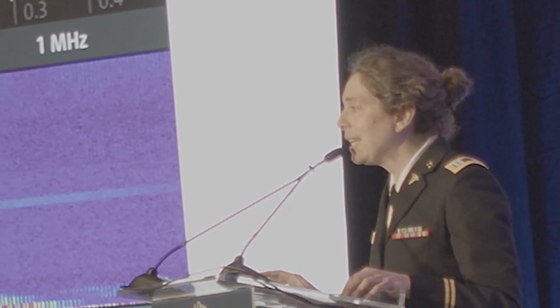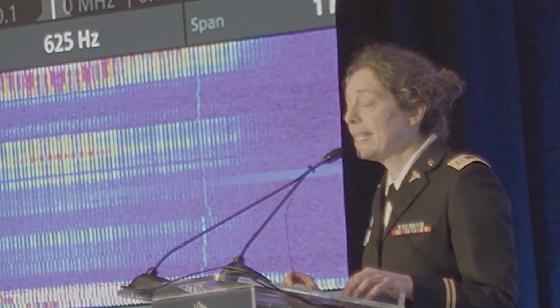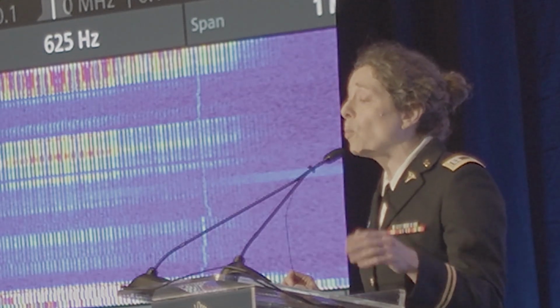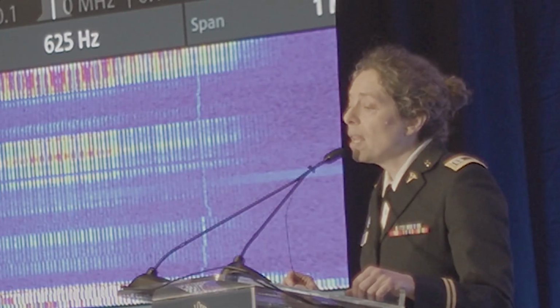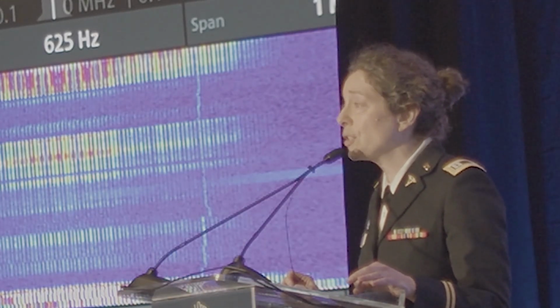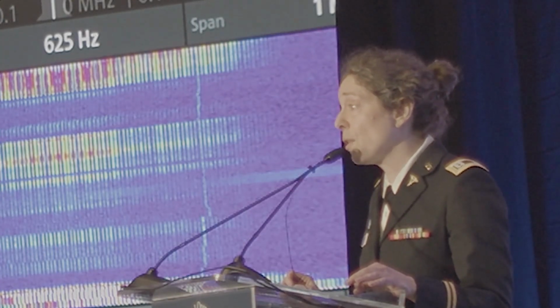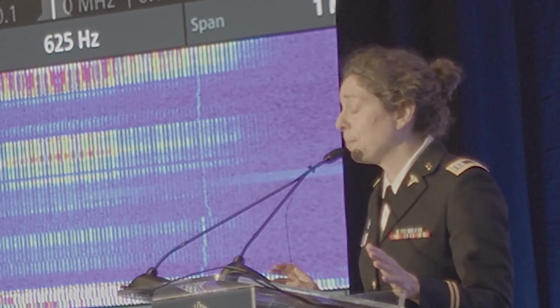Now, what you're seeing here is the GE Vscan Air probe. Its signature was detected at negative 127 decibel milliwatts, but what you're looking at is what a signature looks like when it's masked. Here, the GE Vscan Air probe's electromagnetic signature is overwhelmed by the signature of the radio frequency interference from the trackpad on the ultrasound system.